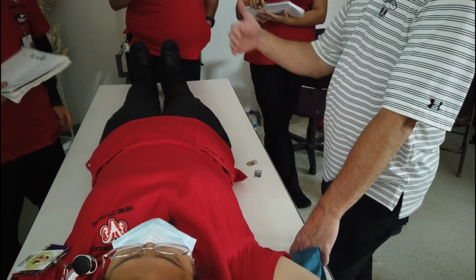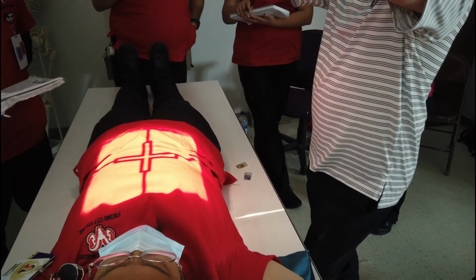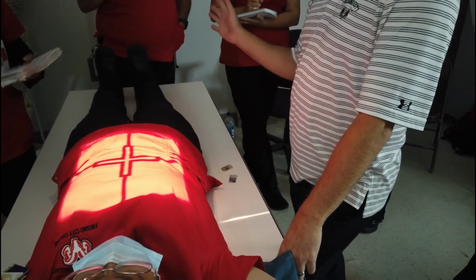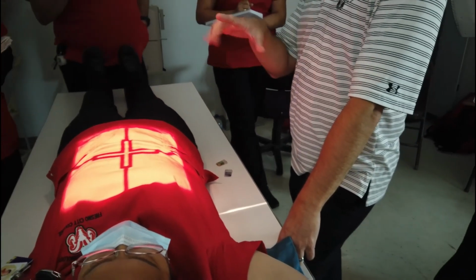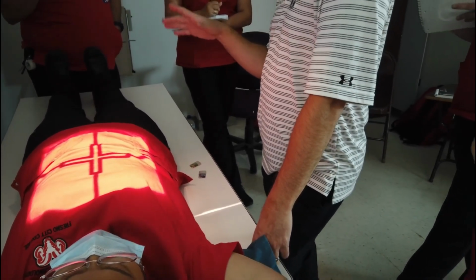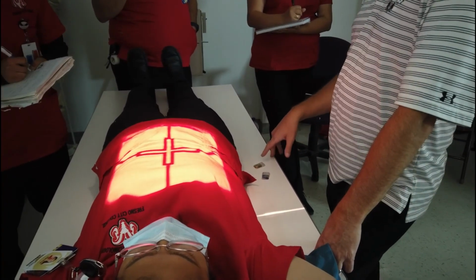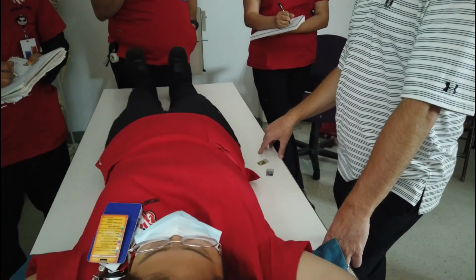You just center at the crest and go in 2 inches. Make sure you use a 14 by 17 for the obliques, using the whole image center. Then you go 2 inches from the ASIS. Center at the crest. You guys have done all this stuff already, right? So I'm going to have you do the kidney shot, and then I'm going to have you do one oblique. I don't need to see both of them. On the obliques I will tell you which kidney I want to see. So if I say do an oblique that's going to show the left kidney and the right ureter, what are you going to do? RPO. Good, good enough.